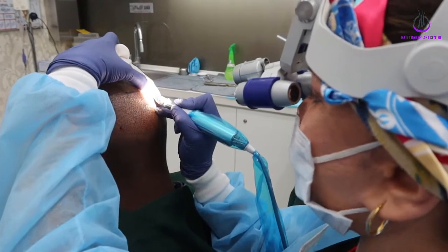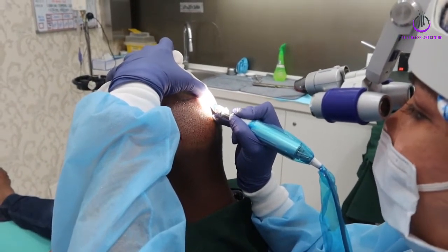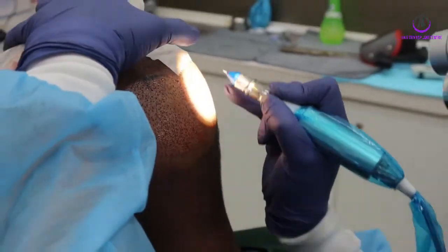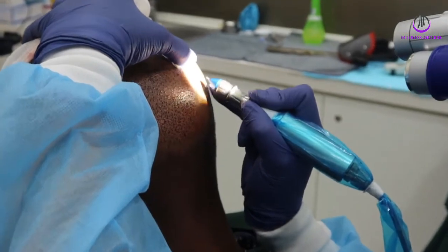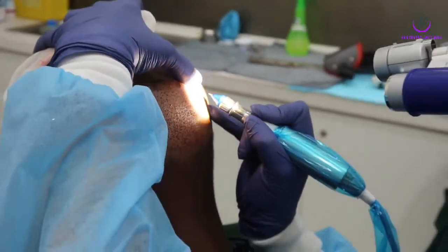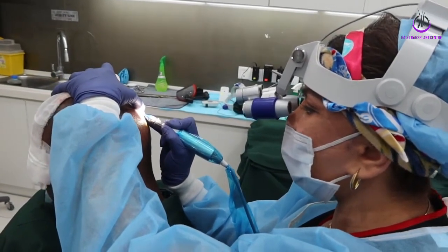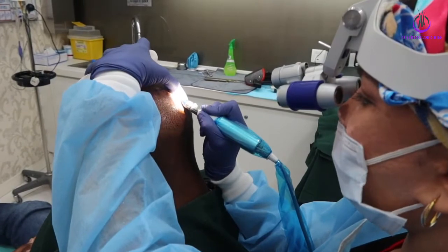When we do FUE, we can actually see the grafts with the number of hairs in each graft. So we can choose. Sometimes we take single hair, sometimes double hair or triple or multiple. One graft may have a single hair, one graft may have 2 hairs, or one graft may have triple or multiple hairs. The specialty of FUE is that if you want a graft with a single hair, you can do it. You can harvest grafts with double follicles or even triple or multiple. So you can cherry pick your grafts.